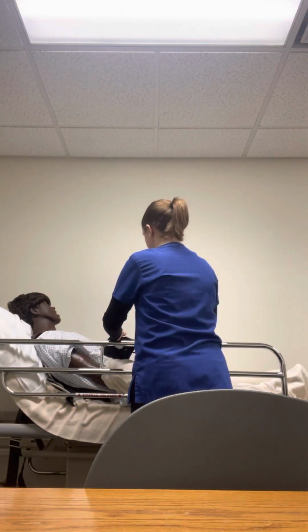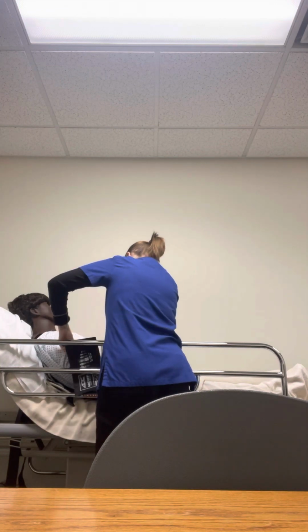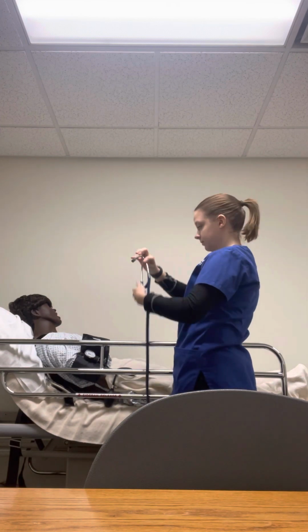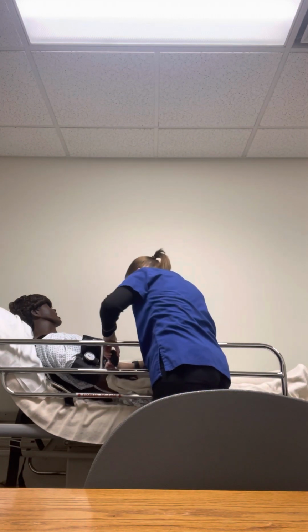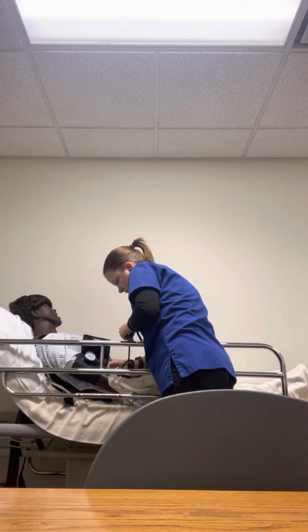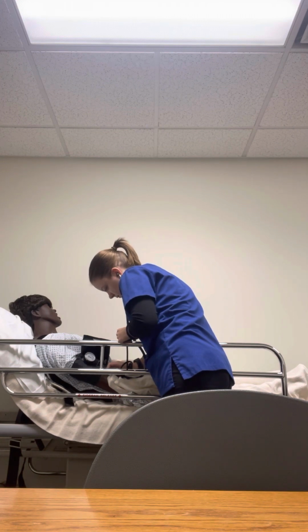I'm going to take her blood pressure. Okay.